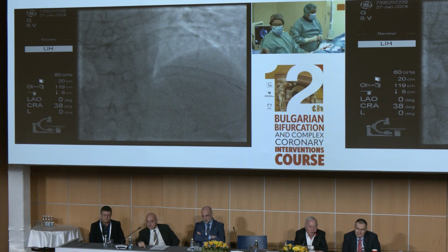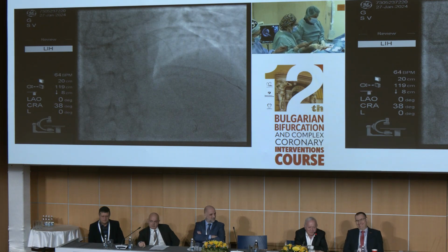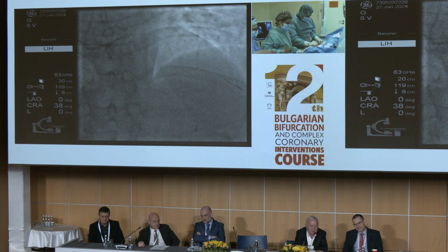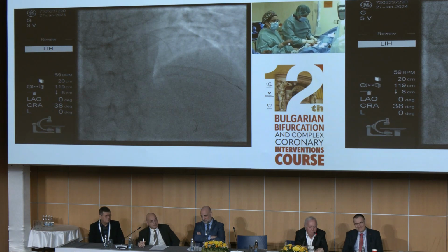For a bifurcation, in this case, where we don't have much concern about longitudinal strain, we would choose one stent with 2 longitudinal connectors. And so we decided to implant Orsiro. Orsiro is interesting for its minimal thickness. And the diameter? 3.0, according to the distance.